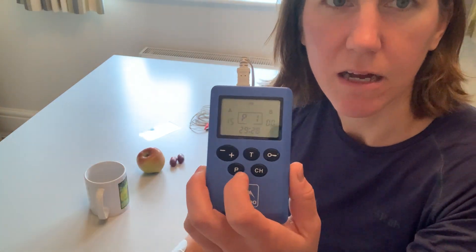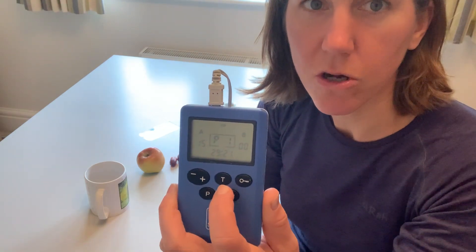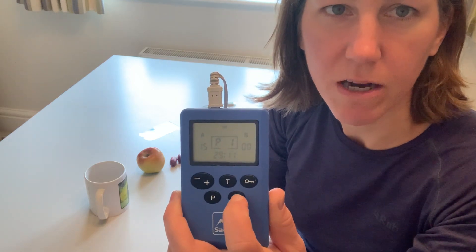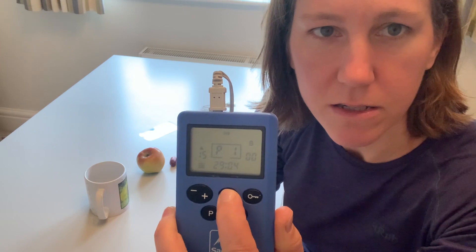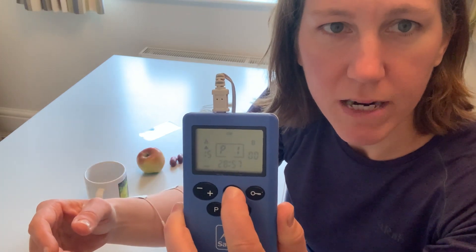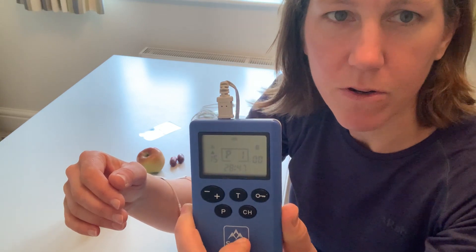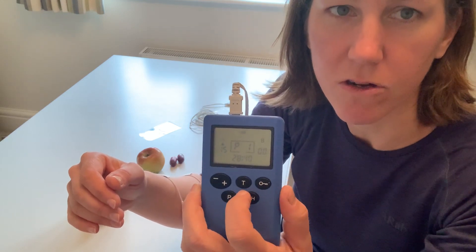The added extra component with the Sabo Stim Pro is that we've got a trigger button, so rather than having to work with the fixed timing, I can control exactly when the stimulation comes on. To set that up, I make the channel flash again, then press and hold the T button until I get a triangle just underneath the A — I'm now in trigger mode. When I press T, the stimulation comes on and stays on the whole time I'm pressing that button. As soon as I let go, the stimulation stops. I've now got much more control over how slowly or quickly I need to move to get hold of the object.